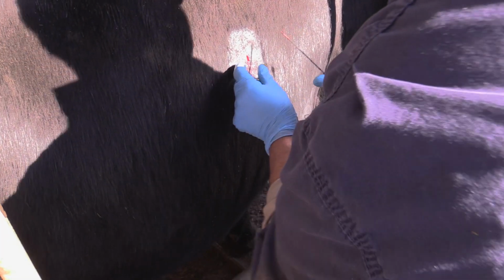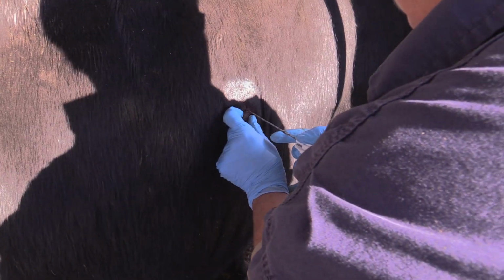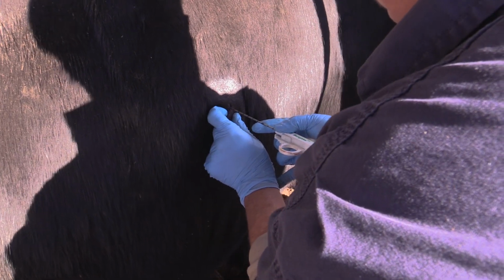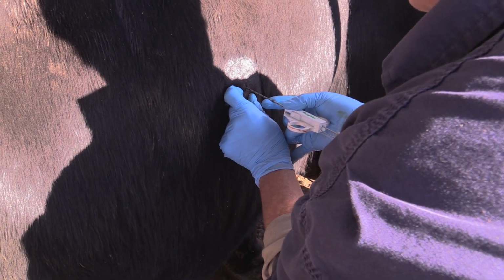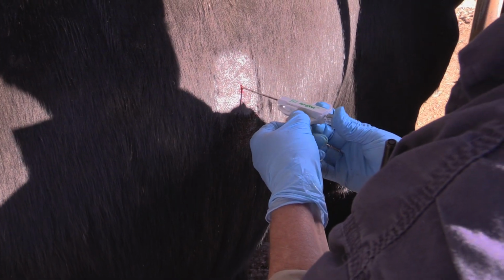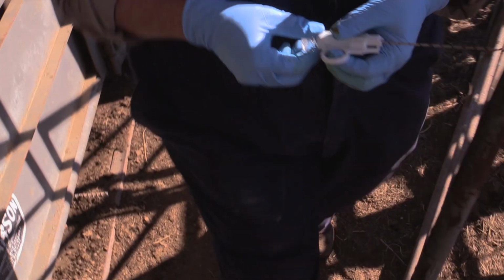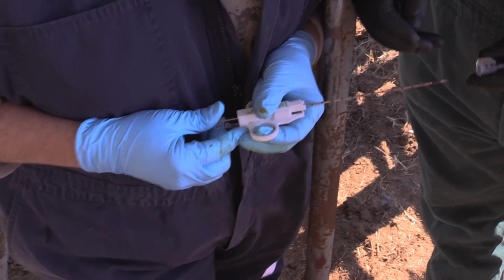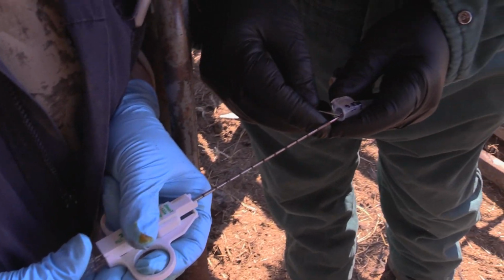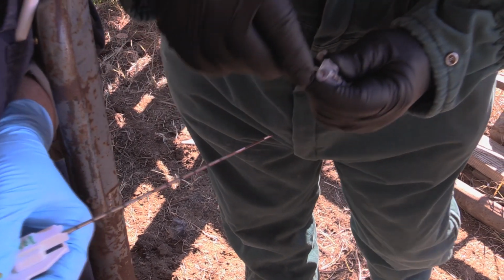Repeat steps 1 through 10 as necessary if a full trough of tissue was not acquired. Glue or suture the stab incision if needed. Apply antibacterial ointment if needed. Samples should be shipped with ice packs for overnight or 2-day delivery. If overnight or 2-day delivery is not possible, freezing the sample until shipping is acceptable.